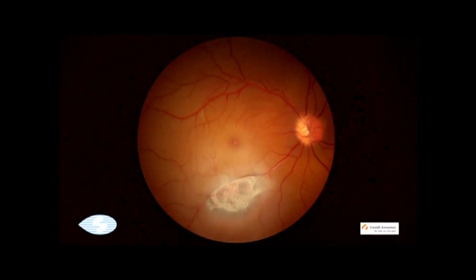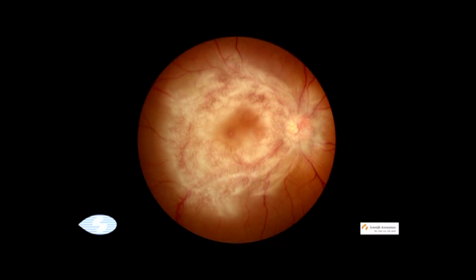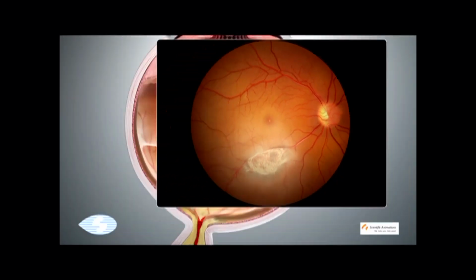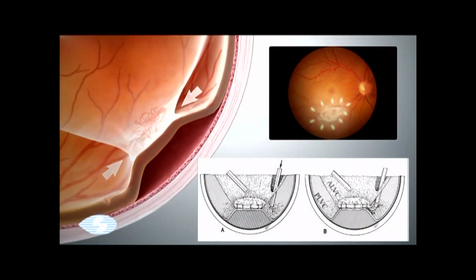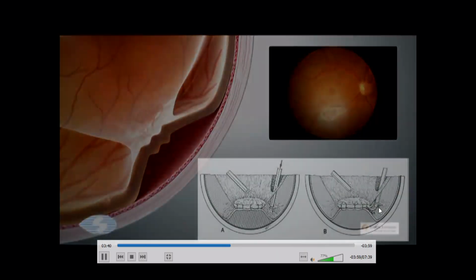We now see this localized traction retinal detachment in the frontal view, and in its extreme form, this can produce a large tabletop traction retinal detachment. Centripetal contraction of the unsplit vitreous cortex can cause folds in the underlying retina. The single most important step in membrane surgery is to identify the posterior leaf of vitreous cortex, and if it is attached, create an edge and a flap of that before proceeding with dissection.